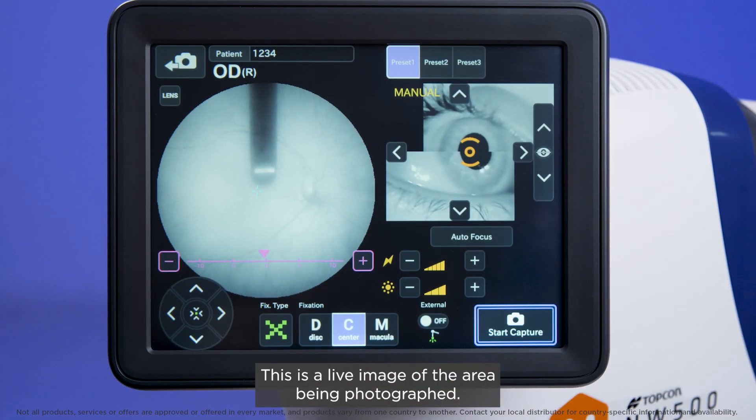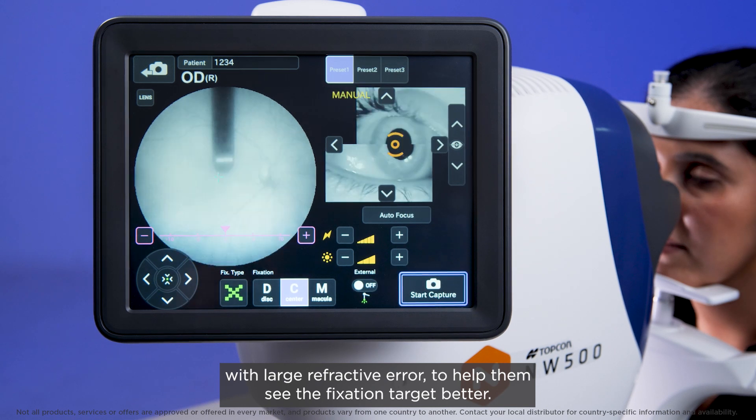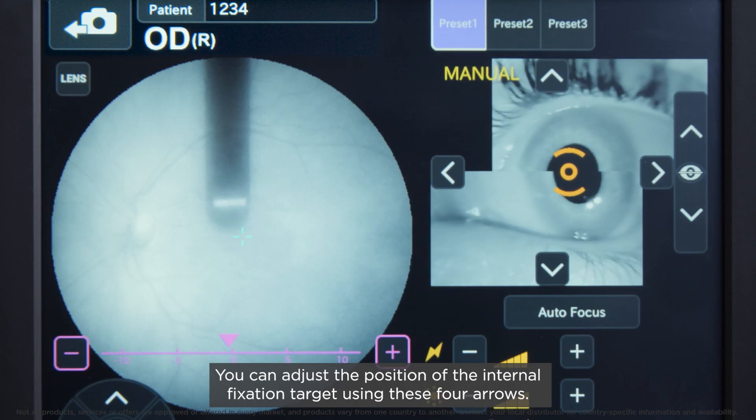This is a live image of the area being photographed. Use these plus and minus buttons to adjust the focus for patients with large refractive error to help them see the fixation target better. You can adjust the position of the internal fixation target using these four arrows.